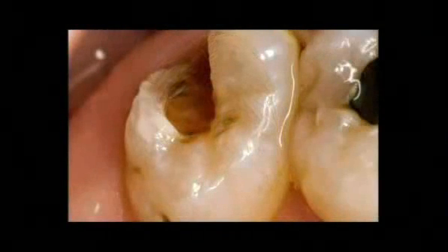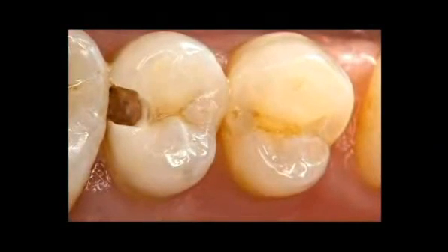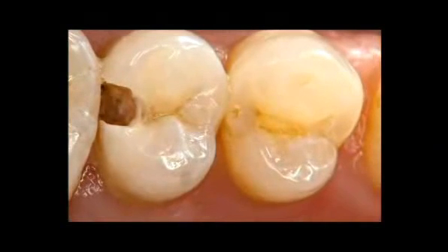A 34-year-old female patient presented with interproximal caries on numerous teeth. An extensive slot cavity in the distal of the maxillary left second premolar is an example of the caries activity. Radiographic review indicates the extent of the carious lesion on the premolar.